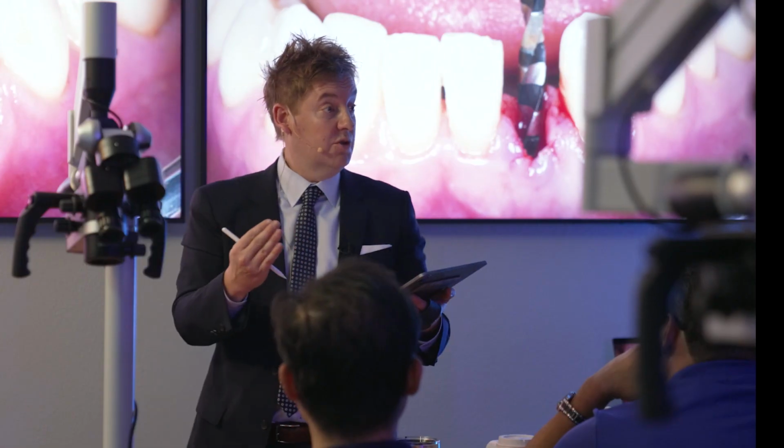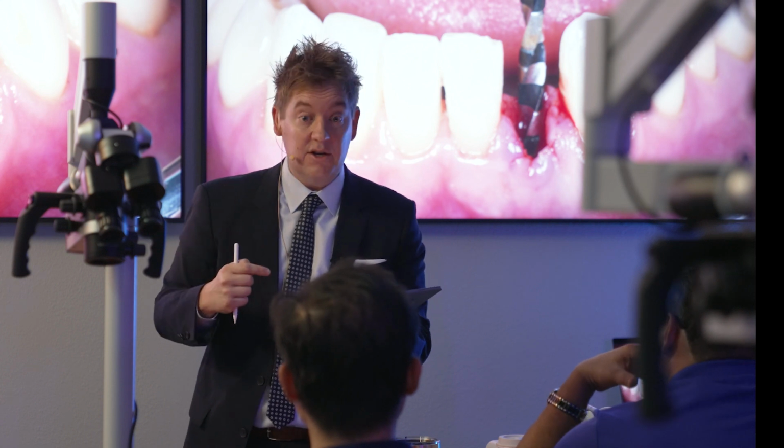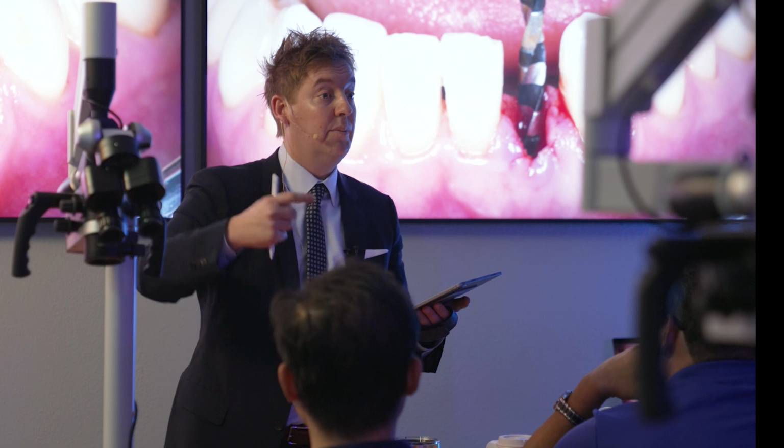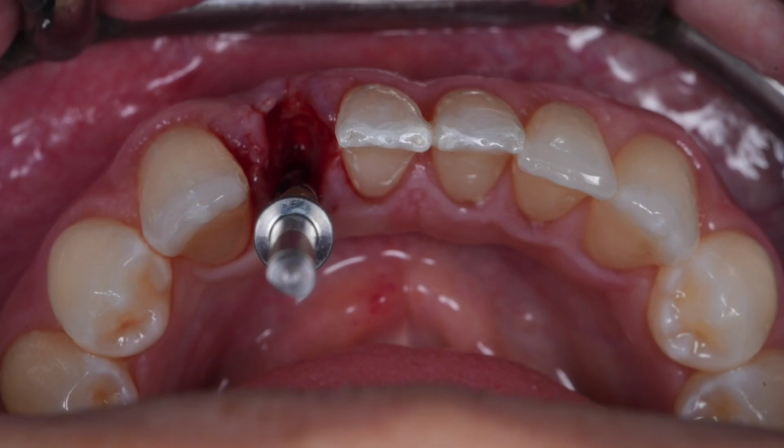We know that the bone resorbs more in the horizontal dimension, from the buccal moving to the lingual, whenever we take a tooth out in a human. That's what happens. But we don't want that to happen if we're trying to replace teeth as if we were never there, which is what we do in our anterior course. We spend 2 days working on this. We know we want the platform of the implant hugging the lingual or palatal wall.